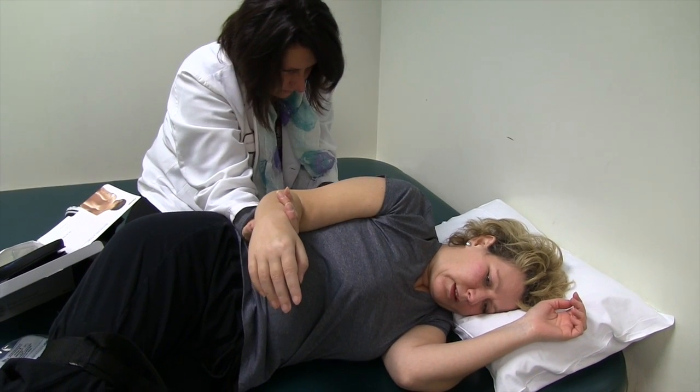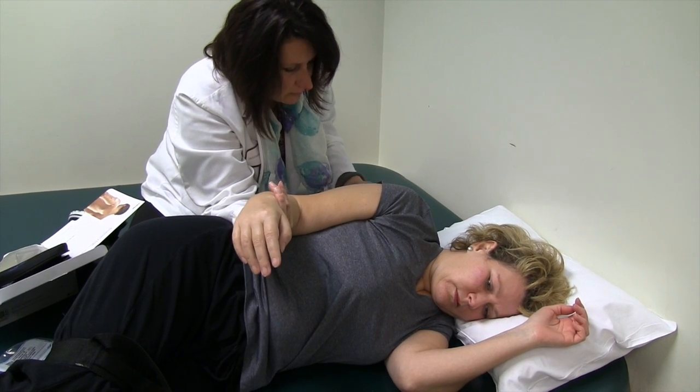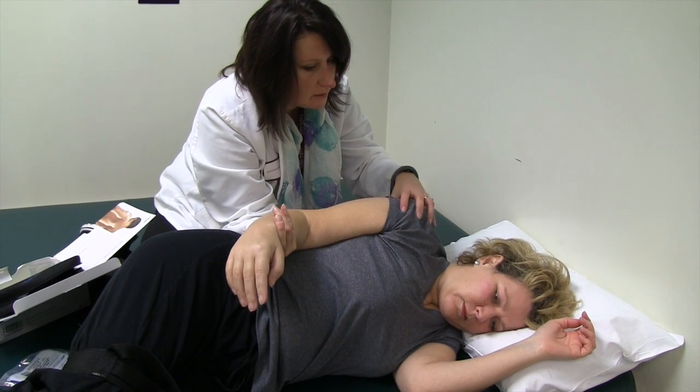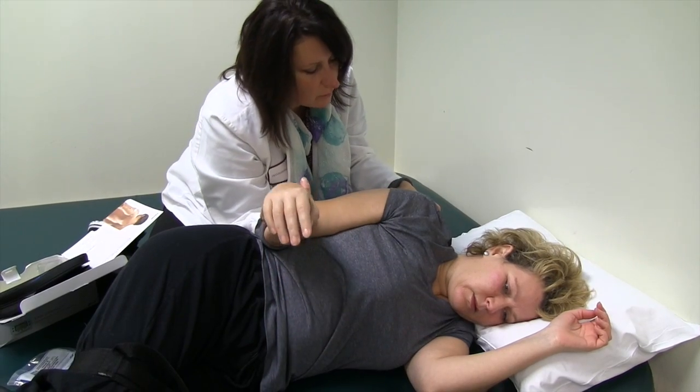I feel like I'm not doing anything. You are — you're firing that muscle, it's weak. That's your weakest muscle right now. The ones that are stabilizing your shoulder — which is why when you're doing a lot of activities and you're sitting, your shoulder is very forward in your joint. The ones that are all back here are your weak ones.